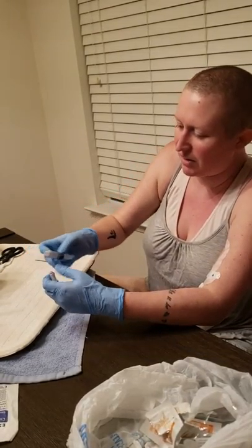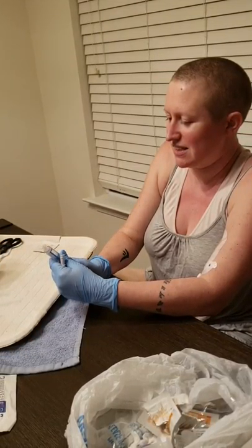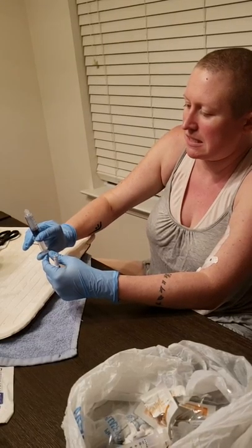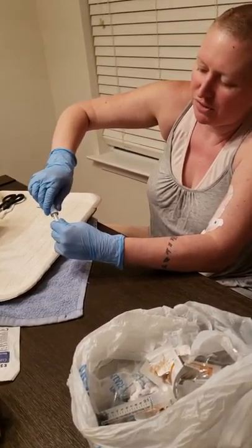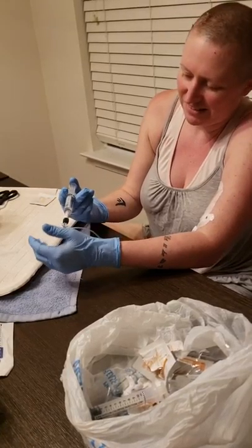Right in the seal — pull back. You can hear a little seal break when you pull back on the heparin. Perfect. You have to push real hard when you screw it in, or else the thing can pop out and get contaminated.